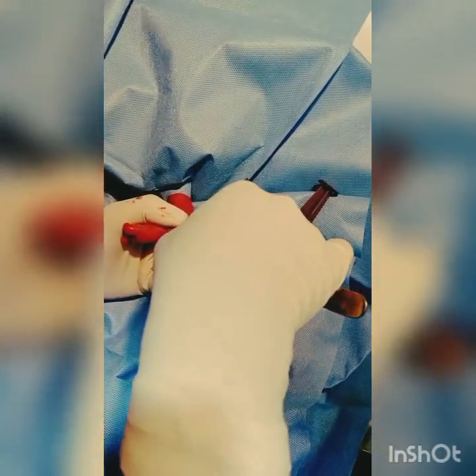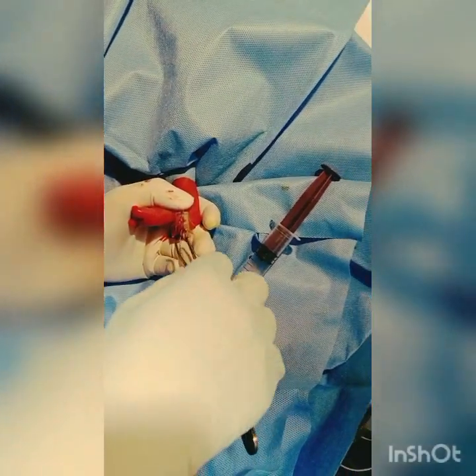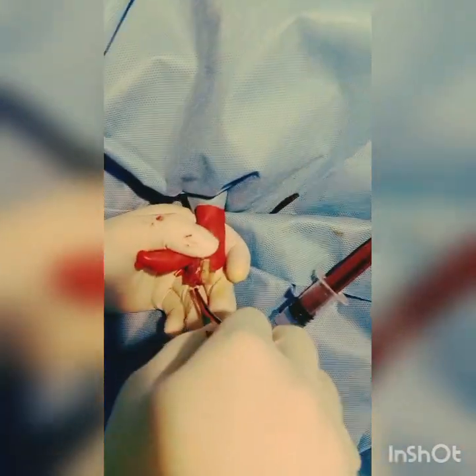Someone can get the ultrasound machine to determine. It's going in easily. What is the length traversed? Almost — around seven centimeters. Almost — no more length is left, I think.